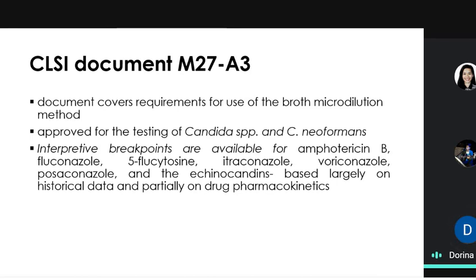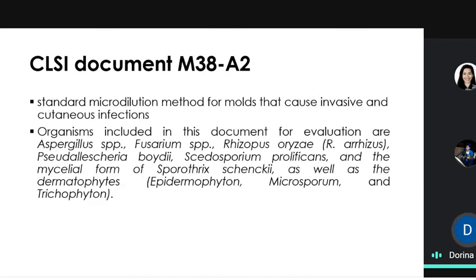Even with bacteria, you have a breakpoint. It is the point at which you can say that it is resistant or susceptible. This seems to be the problem when we're talking about antifungals, from what I read in my Mycology online, with antifungal susceptibility testing. But if you can help me look on the internet, if you have more time and anything to add or share with us regarding antifungal susceptibility testing, that would be much appreciated.